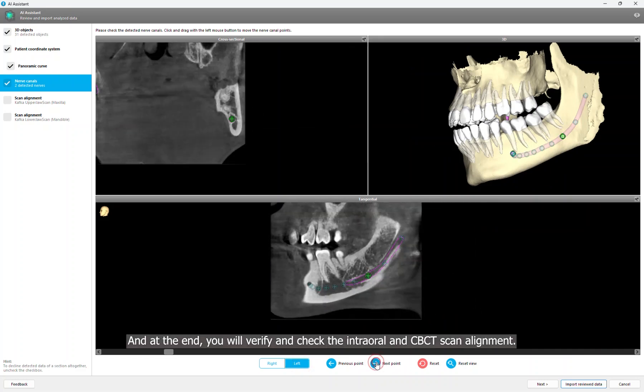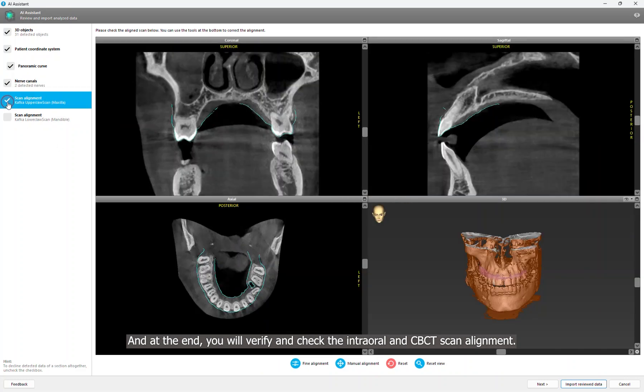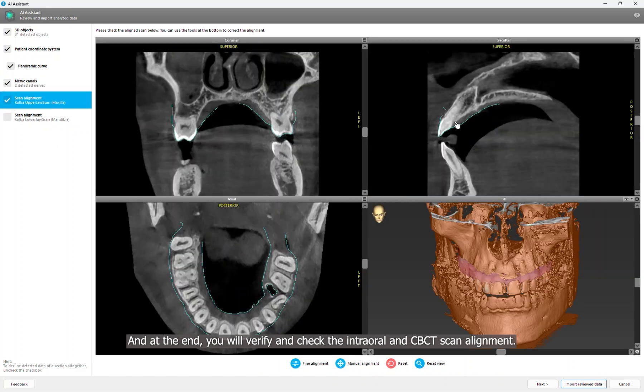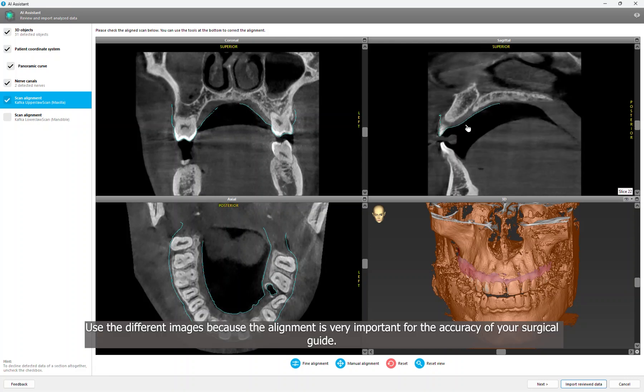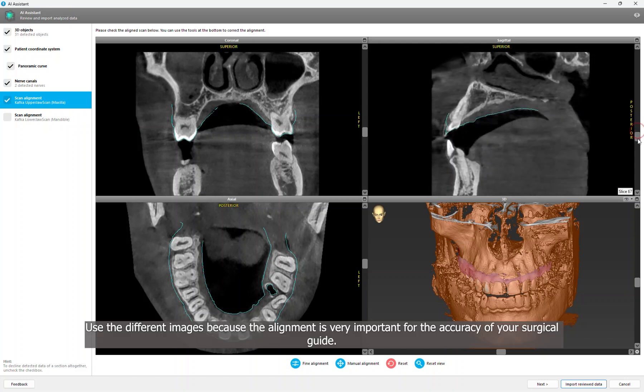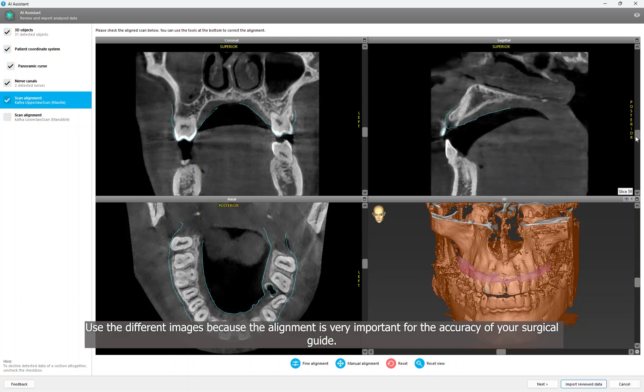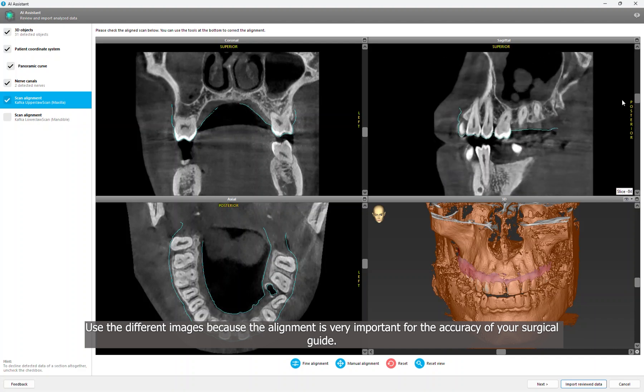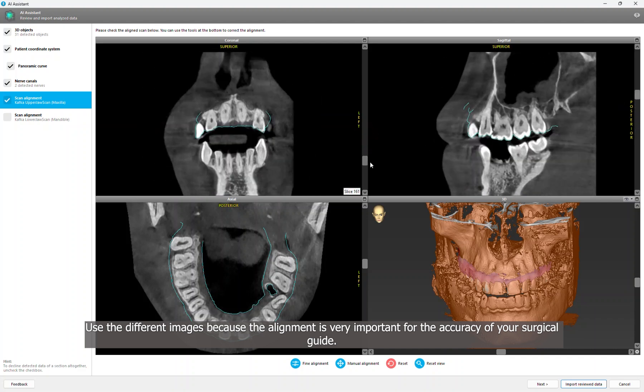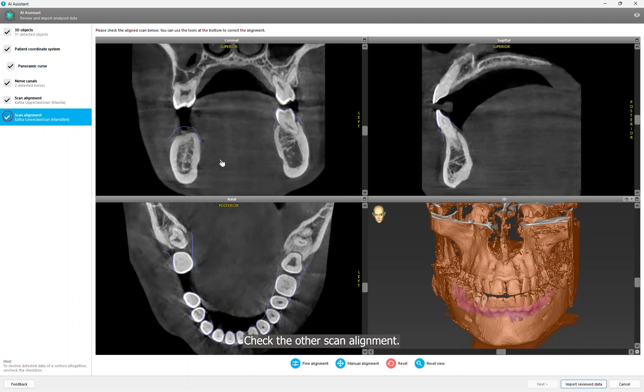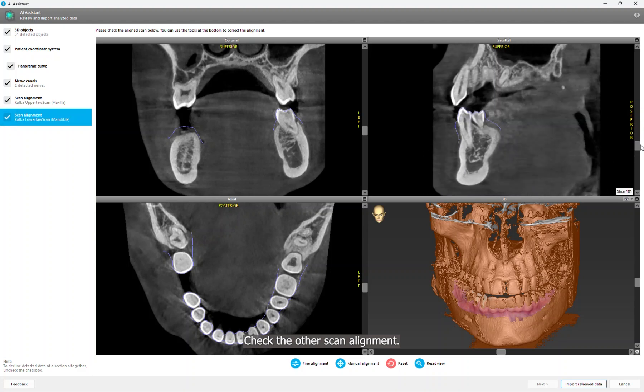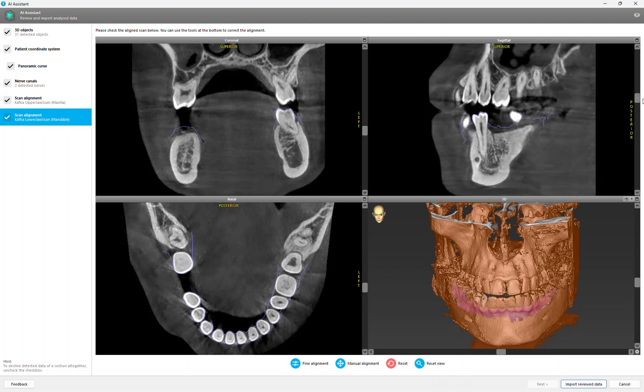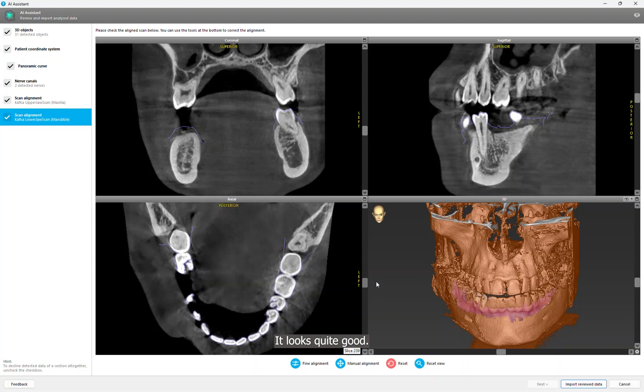And at the end, you will verify and check the intraoral and CBCT scan alignment. The different images, because the alignment is very important for the accuracy of your surgical guide. Check the other scan alignment. It looks quite good.